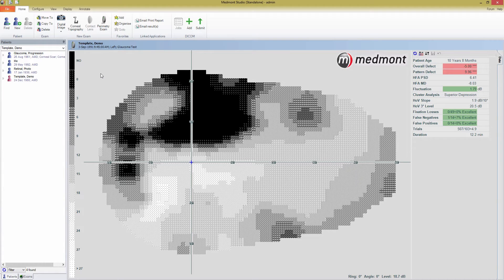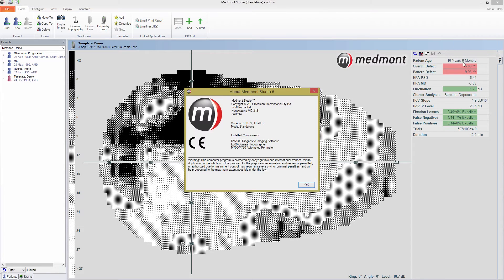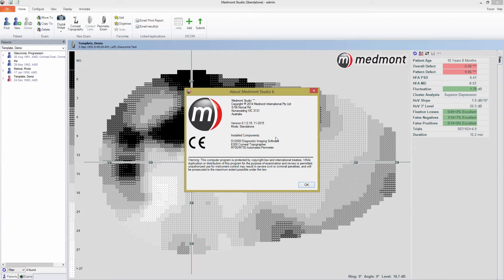If you have Medmont Studio installed from a previous install, you can go to the top right corner and press help, and then about Medmont Studio. Here you'll be able to see the components that you have installed. For example, on this computer, I have our DV2000 imaging software, an E300 topographer, and an M700 perimeter installed.